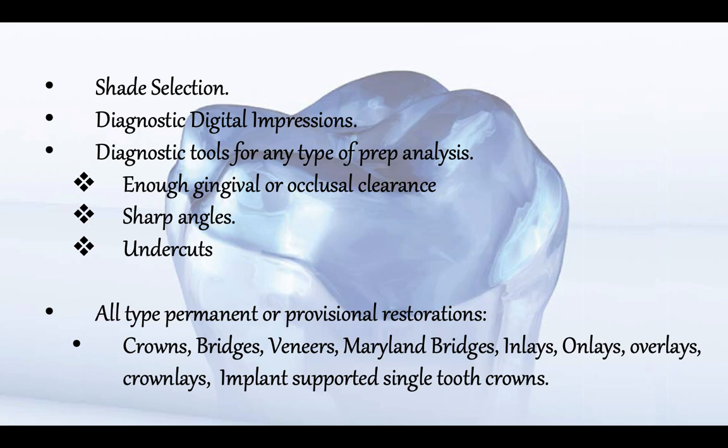Diagnostic tools for any type of prep analysis, as I mentioned previously. You're going to be able to observe if you have enough gingival clearance, enough occlusal clearance, if you have sharp angles, if you have undercuts.